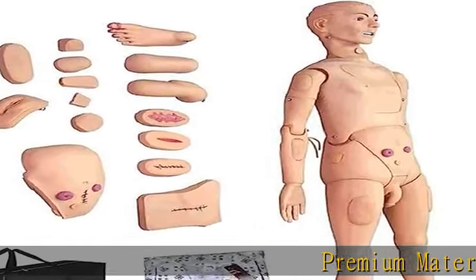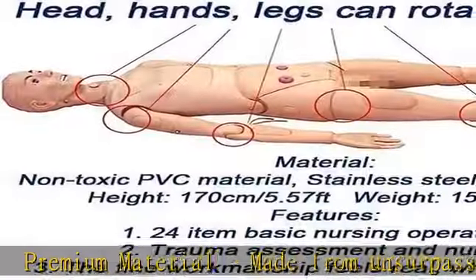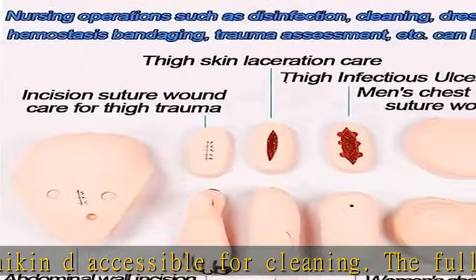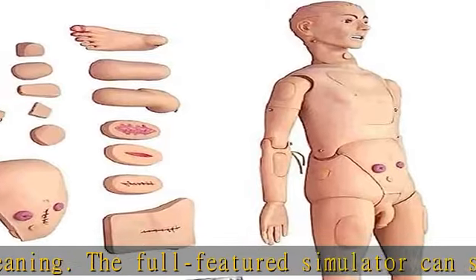Premium material, made from unsurpassed plastic, the Simulator Mannequin is accessible for cleaning. The full-featured simulator can sit on the bed without support. The limbs can move like normal people, and the head moves freely. The fingers and toes are made of soft plastic and can be separated for easy cleaning by conventional methods.